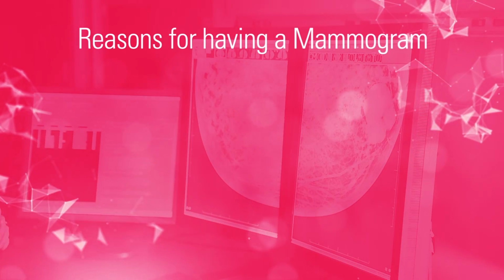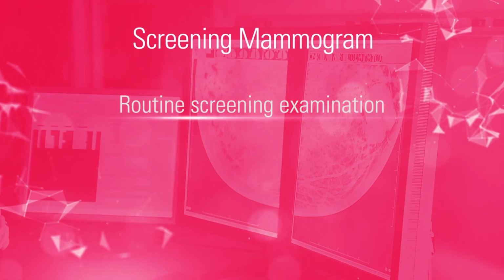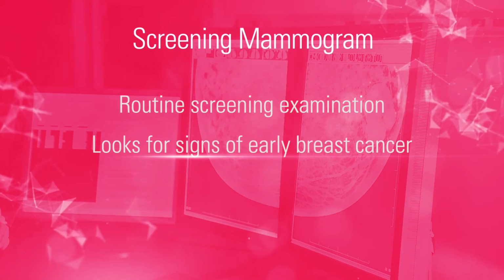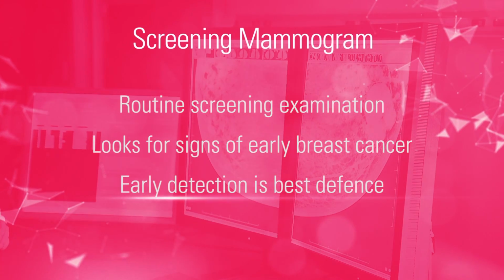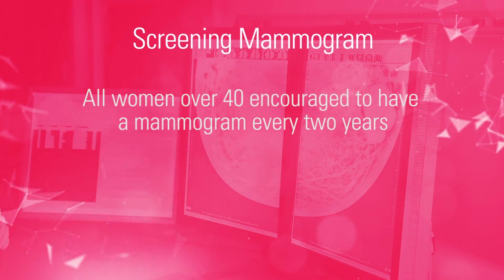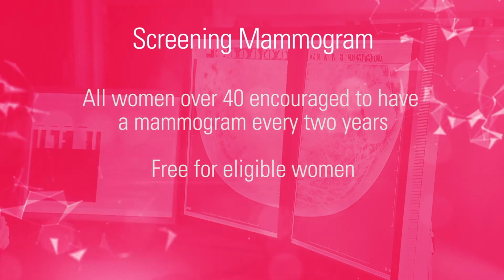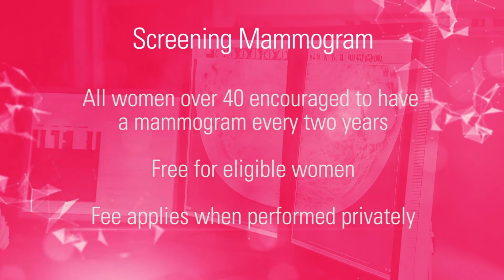There are two main types of mammograms, a screening mammogram and a diagnostic mammogram. A screening mammogram is a routine screening examination that's recommended for all women to look for signs of early breast cancer. Because we can't prevent breast cancer, early detection is the best defense. In Australia, BreastScreen encourages all women over the age of 40 to have a screening mammogram every 2 years. Eligible women can have this mammogram with a government-funded BreastScreen service for free, but some ladies choose to have this examination performed privately for a fee.